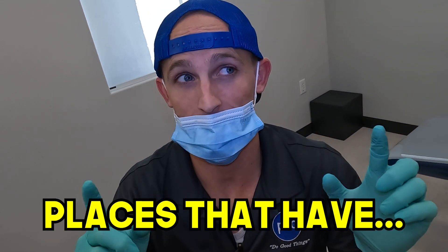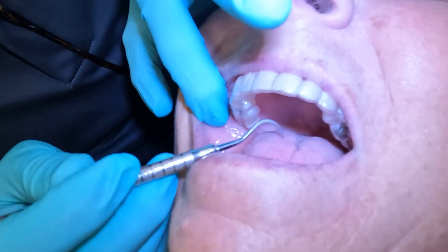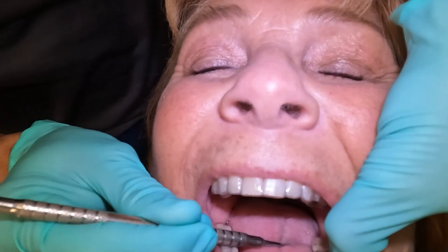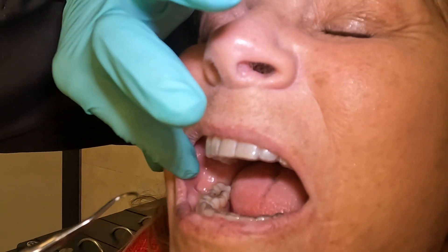That's how you put them in. Now let's talk about how you get them out. I recommend going from places that have the least amount of grab — for me that's more in the back of the mouth, on the top and the bottom. What we like to recommend is coming from the very back on the inside. You get your finger underneath that portion back there — you can do either side. Those in the back tend to be areas where you can get the retainer loose a little bit easier, and then work everything else out.